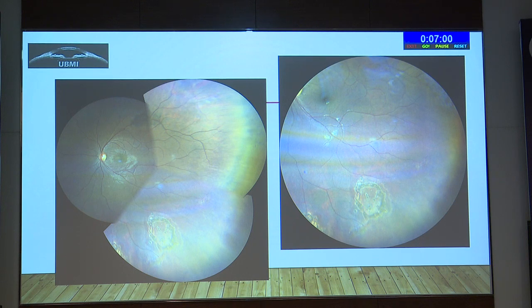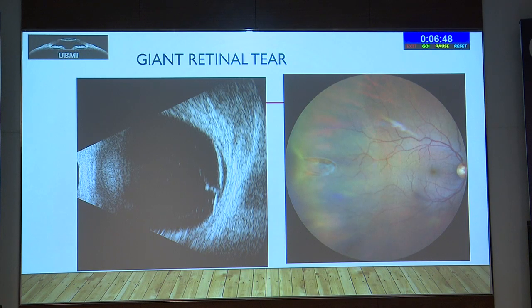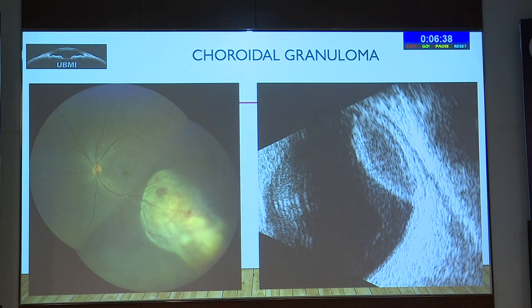These are peripheral degenerations, and you can see the ora very well. You need to slightly angulate the machine to see the ora. It could not come in a standard image absolutely clearly, but it still is possible. So this was a fantastic horseshoe tear seen at the periphery. I could pick it up on ultrasound also. Sorry to say that, but ultrasound can also do it.